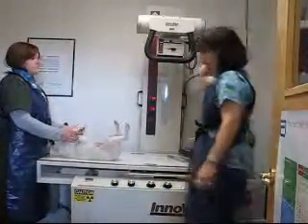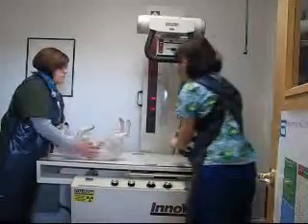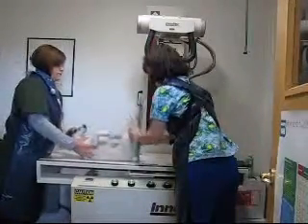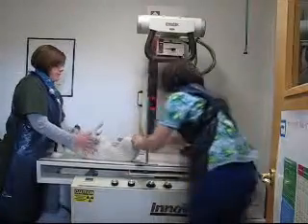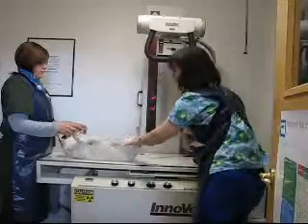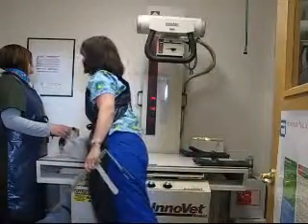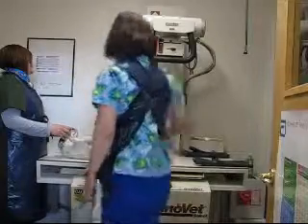We're going to position Miss Little Sexy Lexi for hip x-rays. What I'll do is measure her — she's measuring right at 11. Looking up there, it comes down to be 15 for the pelvis and 62.